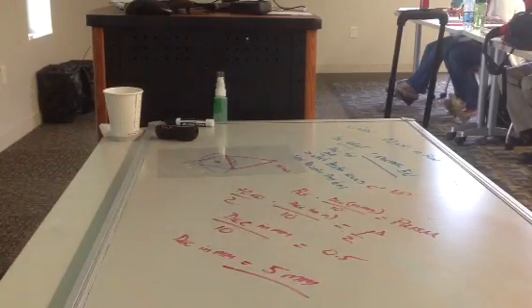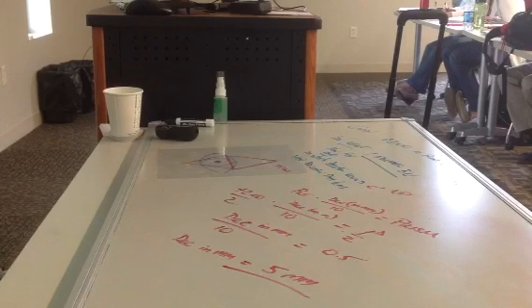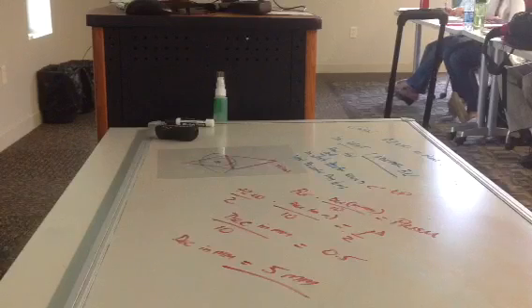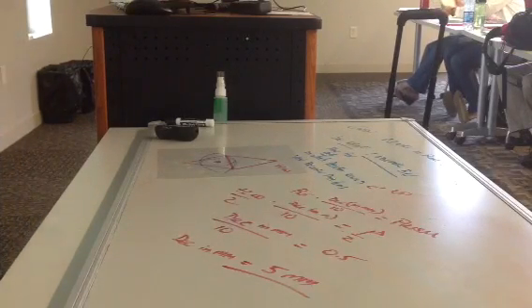The answer would be you're going to move that +2 lens 5 millimeters up to get what you need. And the easier way to look at this is I always use things in tens. If I move this plus lens 10 millimeters up, 2 times 10 divided by 10 is 2 prism diopters. I want 1 prism diopter, so I'm going to go half that, 5 millimeters. That's easier for me, but this is the right way to do it.